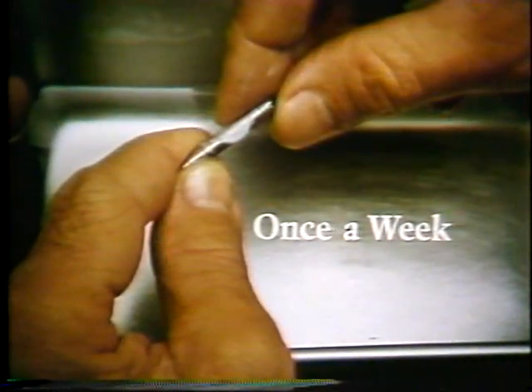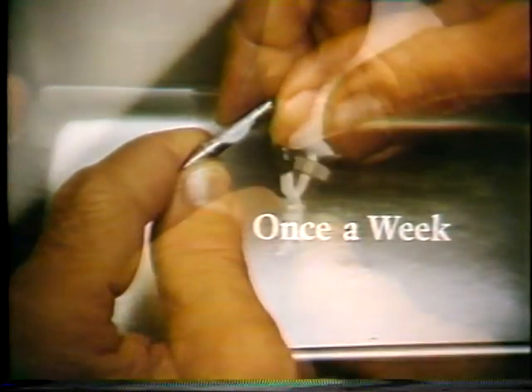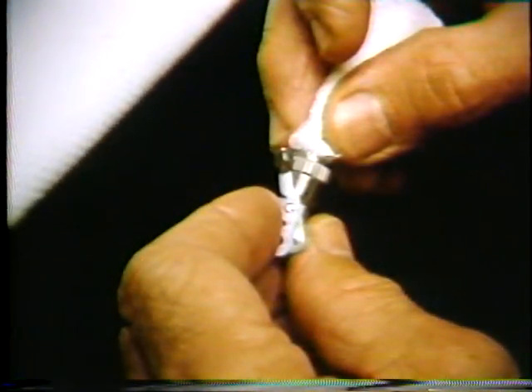Once a week, you should take the contra-angle apart and scrub the shaft and the contra-angle sheath with soap and water. Dry both parts and then dip them in alcohol, or you can wipe them off with an alcohol pad.